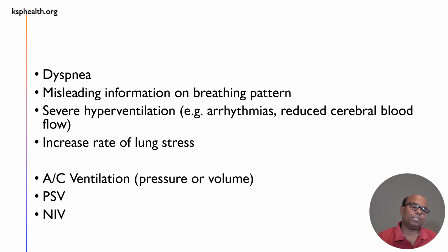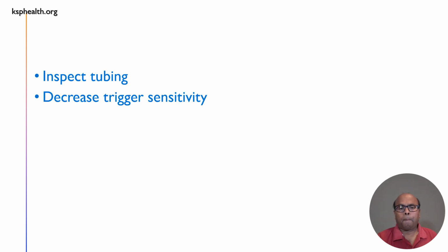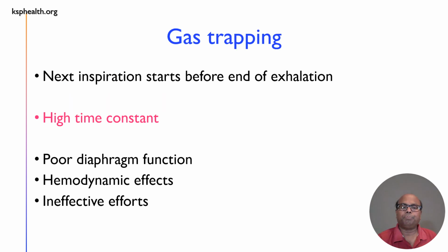It's seen in AC ventilation, pressure support, and non-invasive ventilation. How do you resolve it? Inspect the tubing, make sure there is no water logging and it is not obstructed, and check the trigger sensitivity. It may be very sensitive and detect small changes.